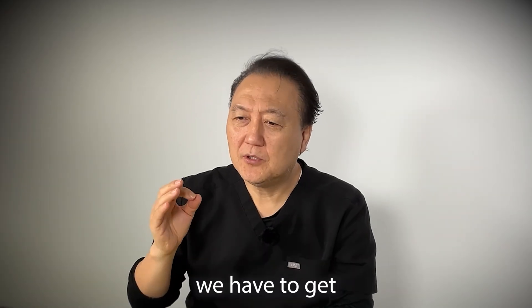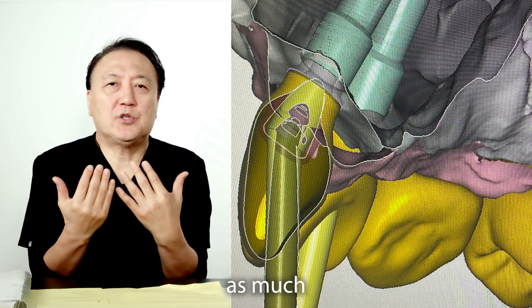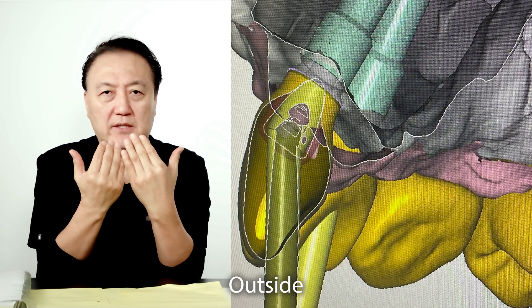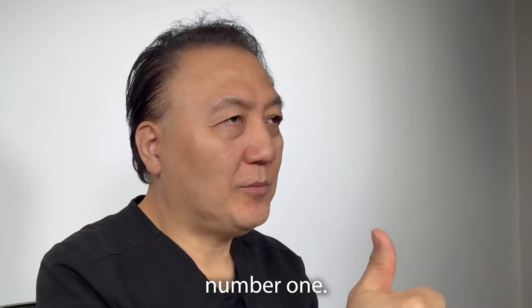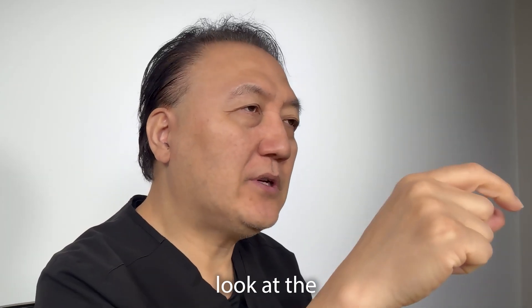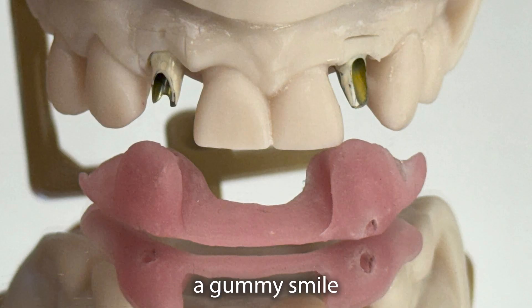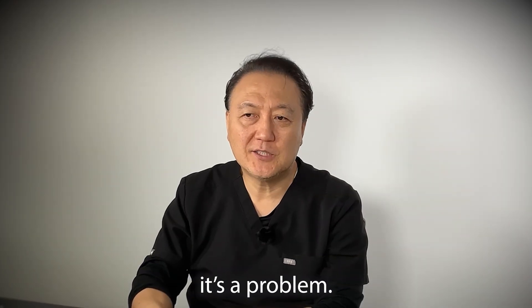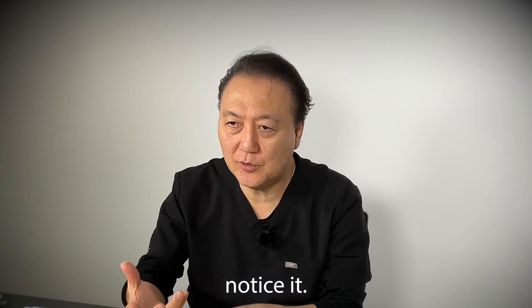First, we have to get correct angulation. We have to bring it in as much as possible — it depends on the adjacent tooth outside and bring it inside as much as possible. That's number one. Number two, we have to look at the implant size compared to the adjacent tooth tissue height. Whenever they have a gummy smile and the tissue size is at a different level, cosmetically it's a problem. It's displeasing — maybe they don't notice it, but I do notice it.